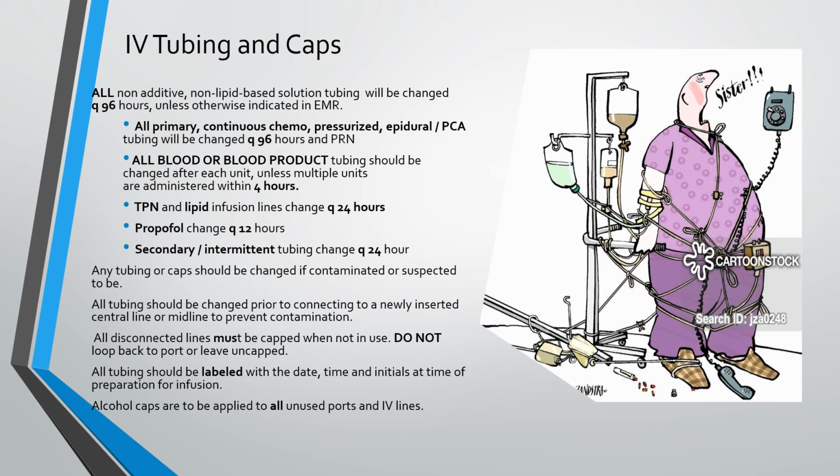Propofol lines should be changed Q12 hours. All secondary and intermittent tubing should be changed Q24 hours. Any tubing or cap should be changed if contaminated or suspected to be. All tubing should be changed prior to connecting to a newly inserted central line or midline to prevent contamination.